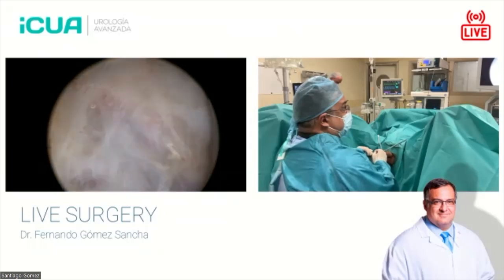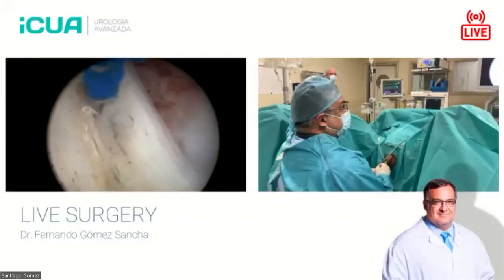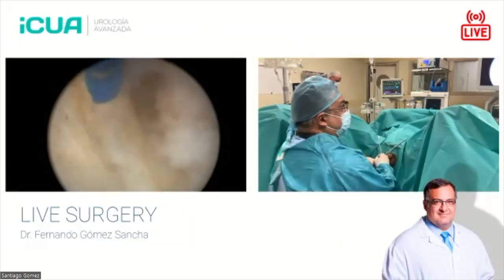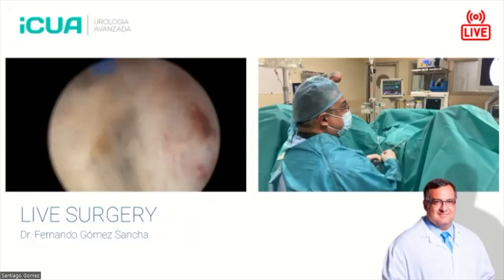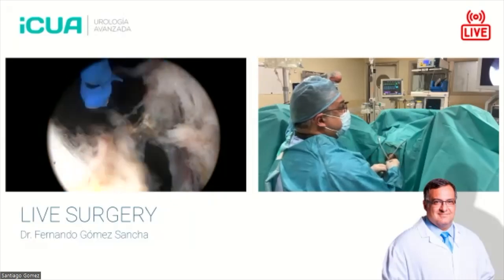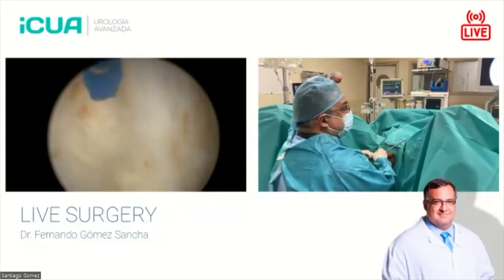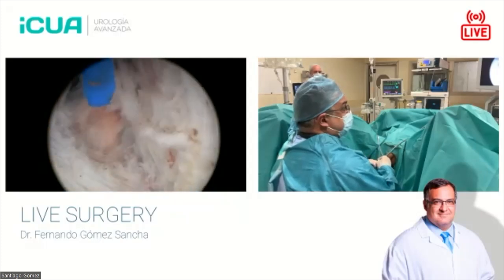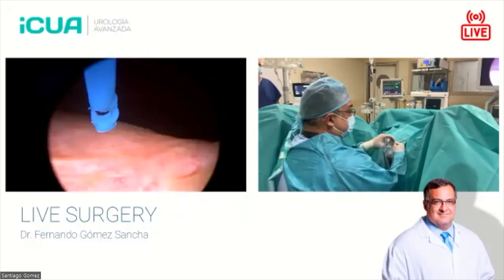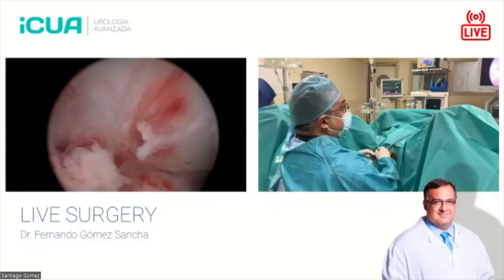So, yeah, buy this expensive equipment. And if you can get your hands on a 150-watt laser, I would say that although you can perfectly work with the 100-watt laser, 150 gives you a better solution. For one, and this is the best thing that I love about the laser from Quanta, it's a very silent laser. It doesn't make a lot of noise. Some low power lasers are like airplanes in the operating room, they are so loud. If you have to stay many hours a week operating with a laser, you want the laser to be quite silent.